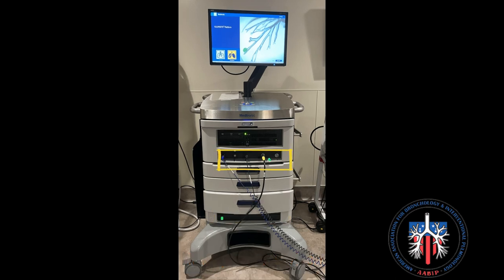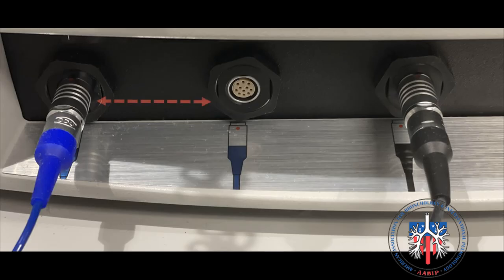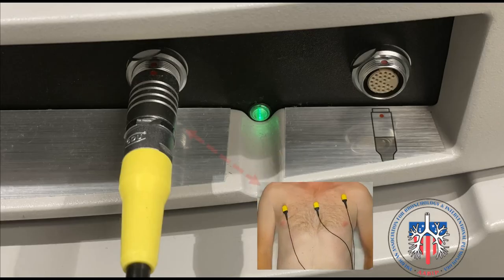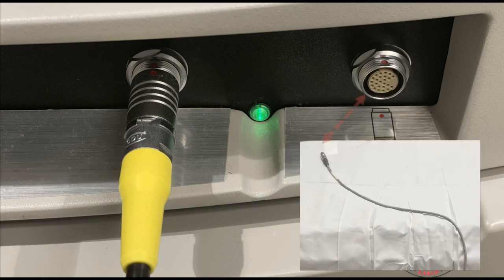Next is cable attachment. The blue extended working channel cable is attached at either of these two locations. The black locatable guide cable is attached here. The patient sensor cable is attached here, and the location board cable is plugged in here.